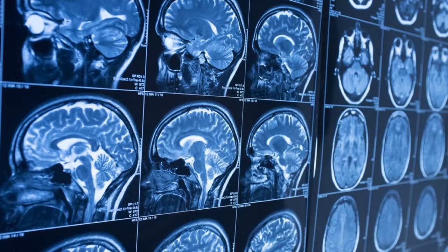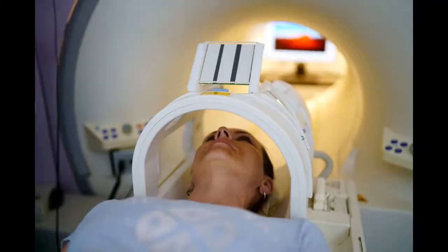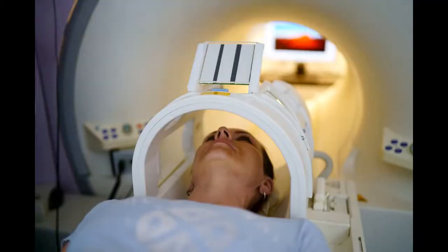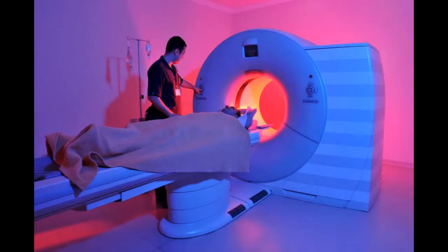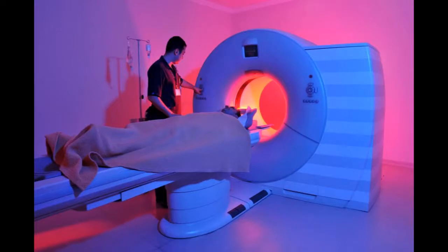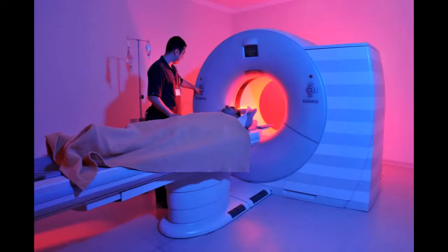It is used for neuroimaging, cardiovascular, musculoskeletal, liver and gastrointestinal, angiography, and contrast agents.